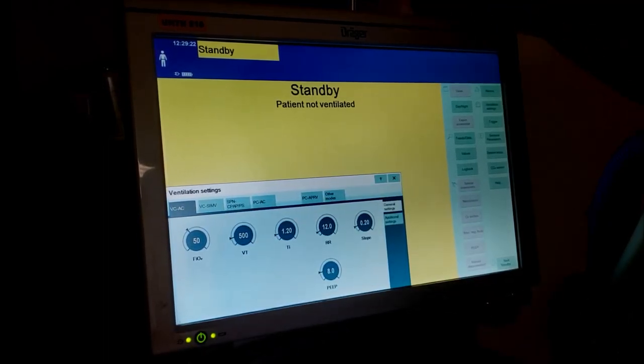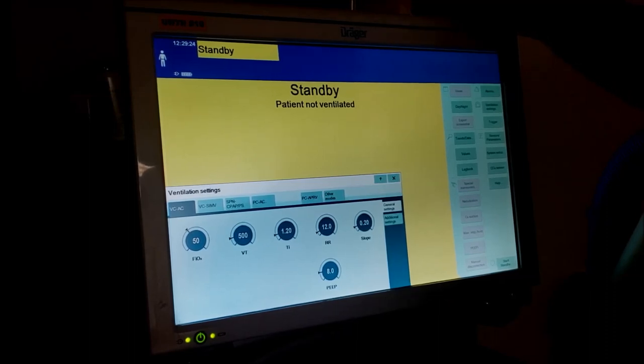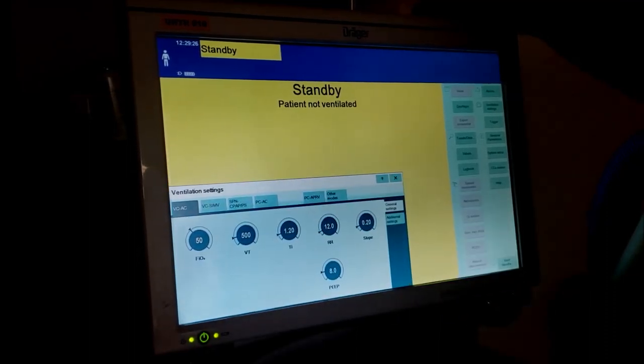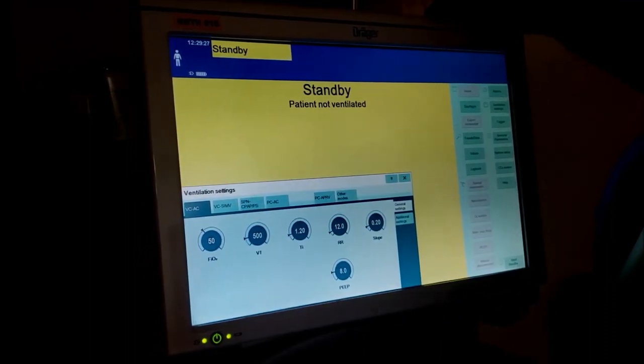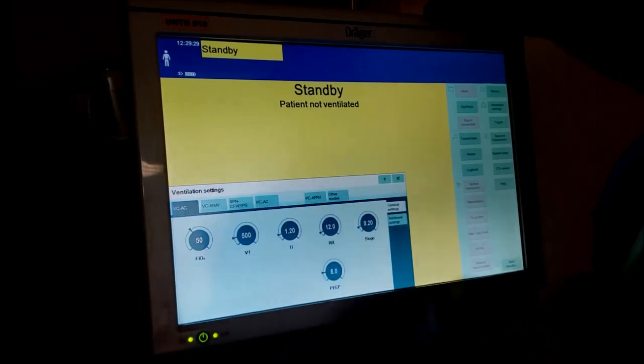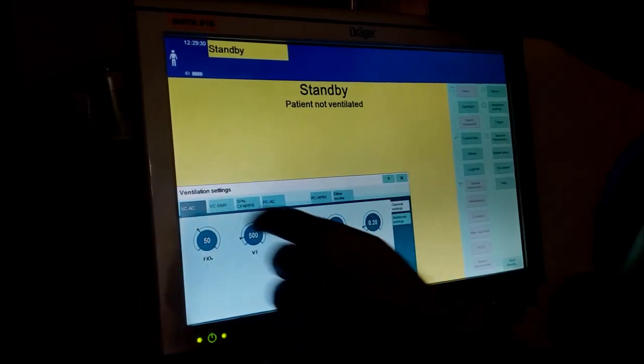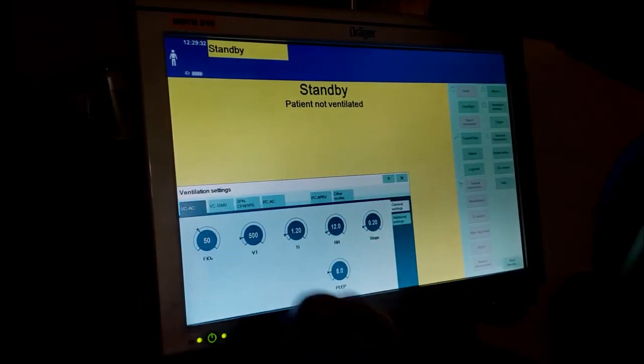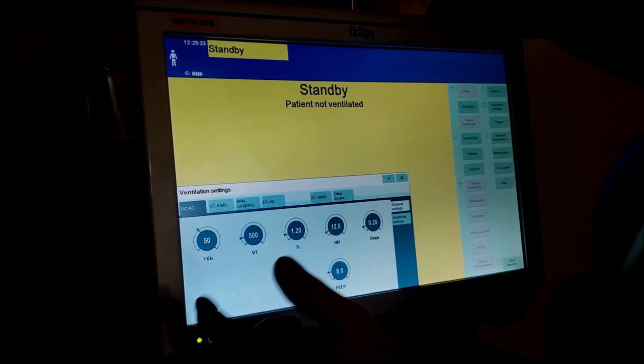SIMV stands for synchronized intermittent mandatory ventilation, which we don't deal a lot with. The last one is the patient's breathing on their own and we're giving pressure support to CPAP. Let's start with the first mode.